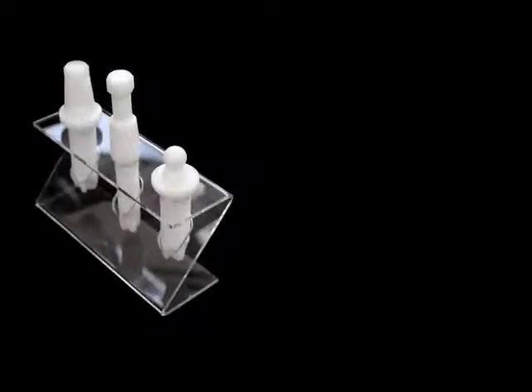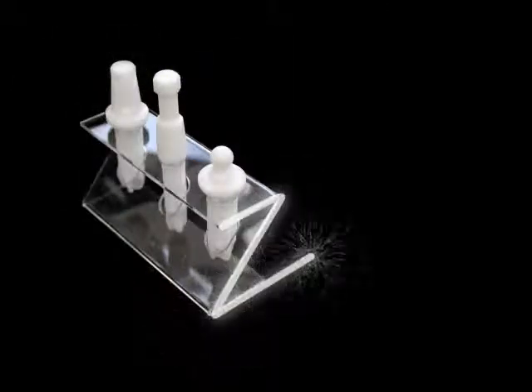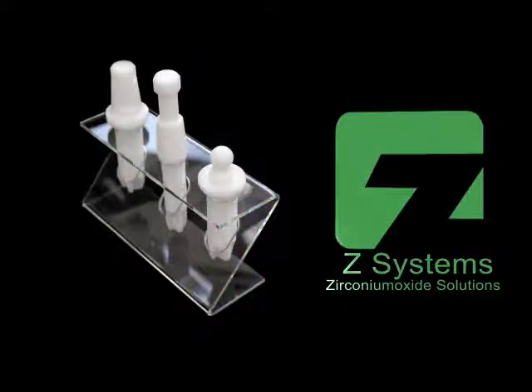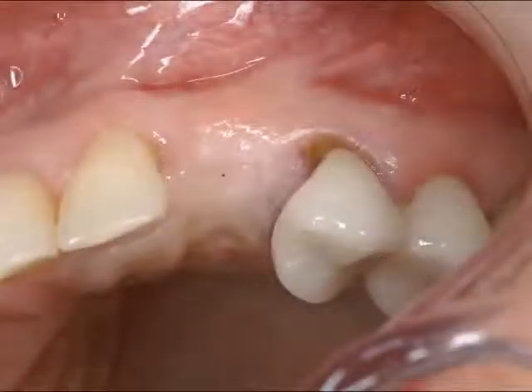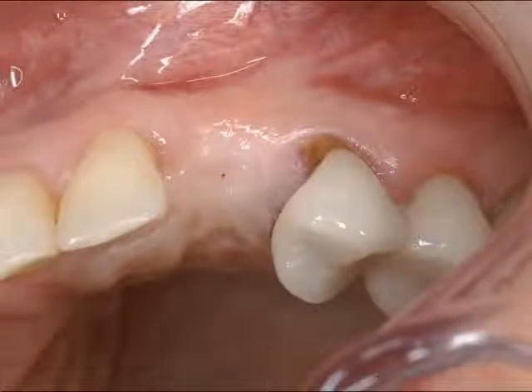Welcome to Dental XP. I'm Dr. Maurice Salama, and today I'm going to be highlighting a case in which we utilized a non-metallic option for tooth replacement. A zirconium implant system, Z Systems, is going to be utilized to treat a patient with a history of metallic allergies. A zirconium gives us an option to provide the patient with a non-titanium option for tooth replacement.